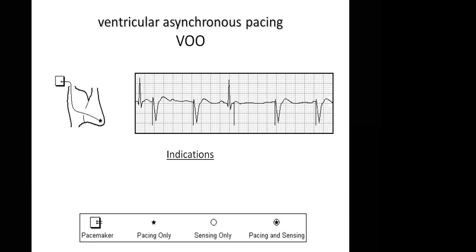The patient is going to the theater, and you are going to use an electrocautery diathermy machine that will make the pacemaker sense electrical waves. That is not true. Then you convert the patient to VOO. It's just for a short period, for the space of the surgery, or for a short period when he's doing an MRI. Then immediately after, you reprogram it back to normal.